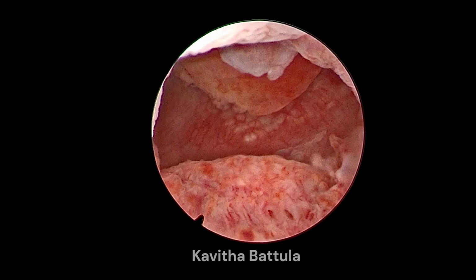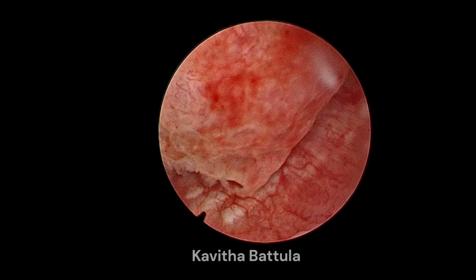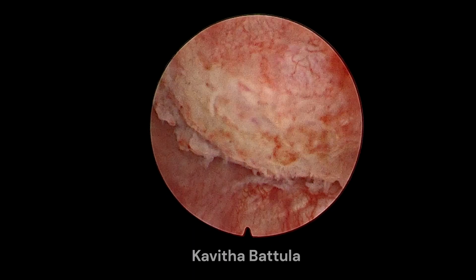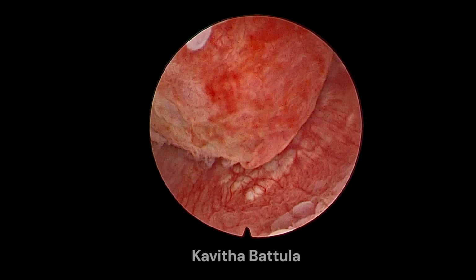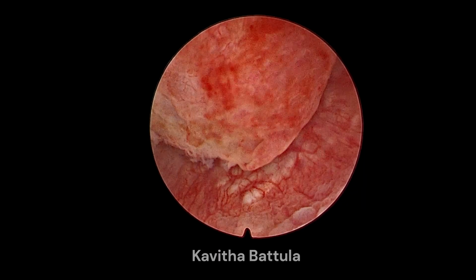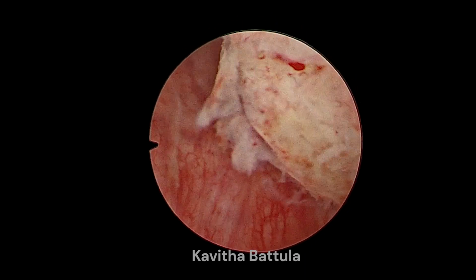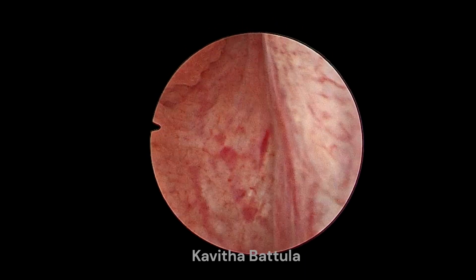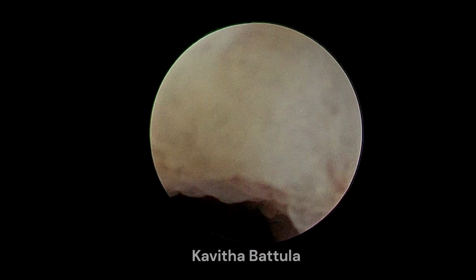Here is a patient who had a second trimester miscarriage and later she had a DNC. On ultrasound, there were multiple fibroids, submucous, and also a fundal intramural larger fibroid around 4 to 5 centimeters. She is planned for hysteroscopy and laparoscopic removal of fibroids.